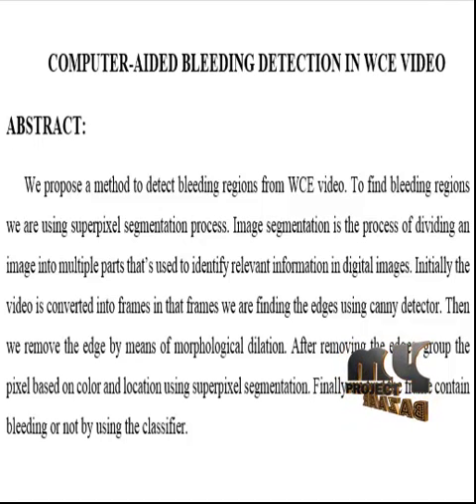In the edge detection process, the first derivative in the x and the y position of the pixels is obtained. The edge detection angle is rounded to one of four angles representing vertical, diagonal, and horizontal components.